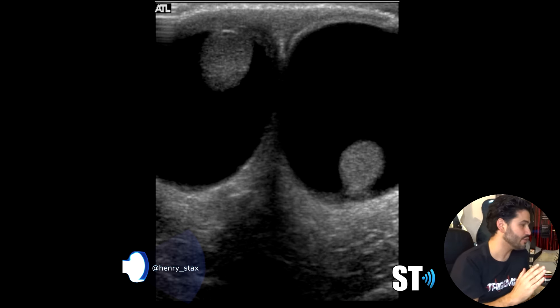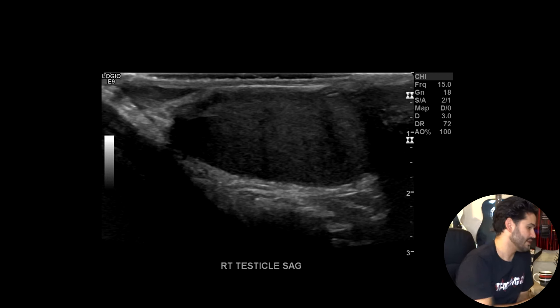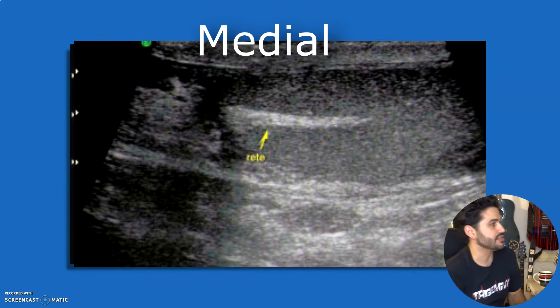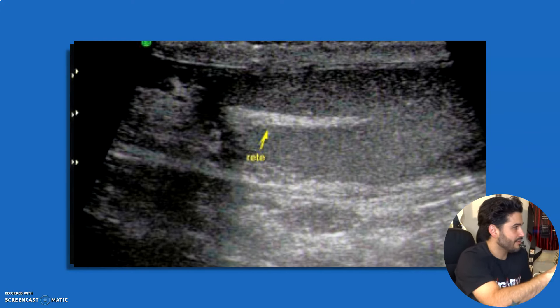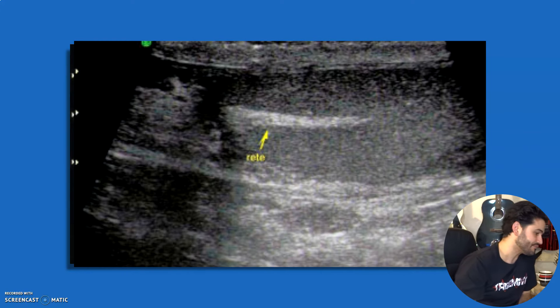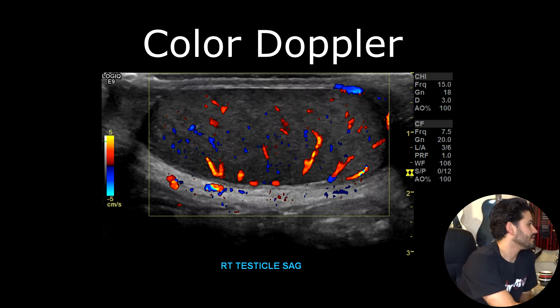Once you're done with the sagittal midline, you want to go lateral. In the lateral view you can still see a bit of the head of the epididymis. Then once you're done with lateral, you want to go medial. In the medial view you can see the mediastinum testis, which is the echogenic band at the hilum of the testicle. Also look for fluid, any testicular lesions or cysts.